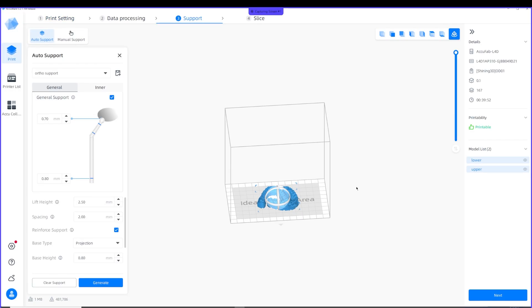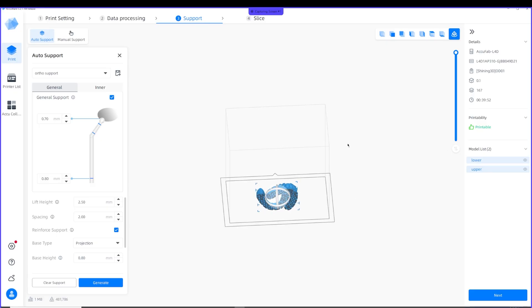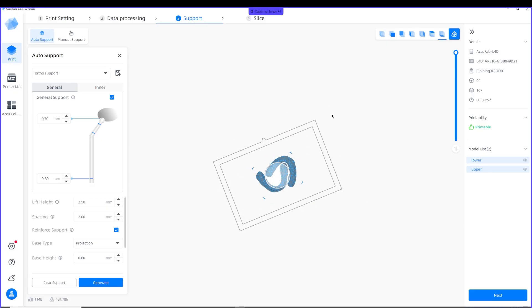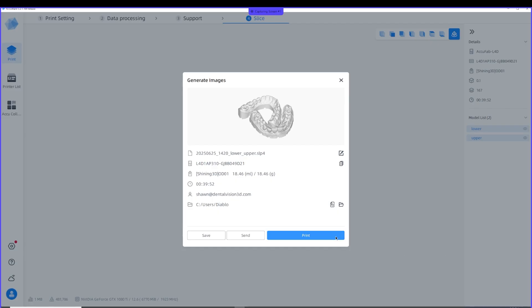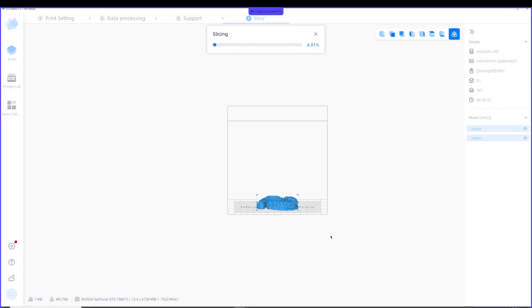For dental models with the honeycomb texture, you do not need supports. They'll lay out just fine. Hit Next, it'll slice it, and then send the print job off.